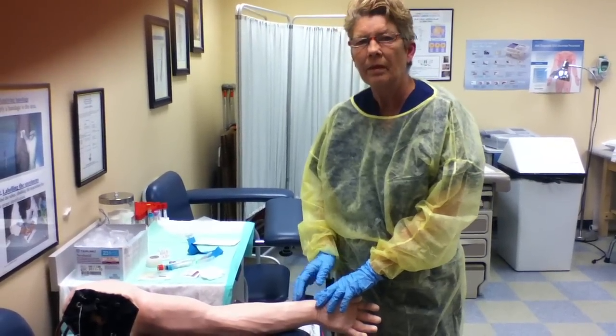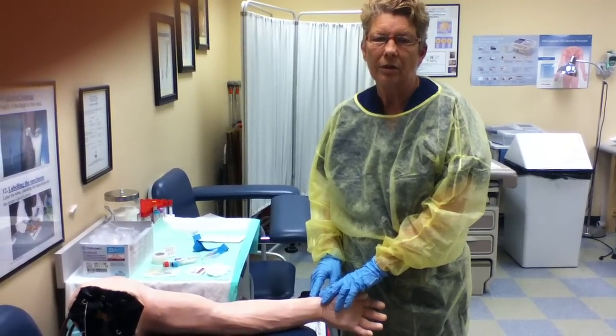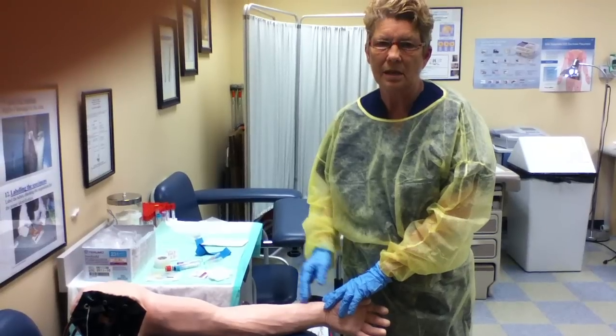I've identified him by his bracelet, the doctor's order, his medical record number, his date of birth, and him saying his name.